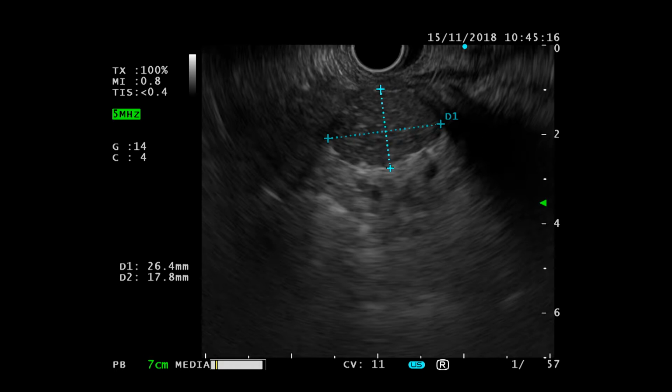I made the point because I'm also concerned about this position, because it's a little bit far down into the duodenum. This may cause some trouble to the advancement of the needle. And the other question to all the experts: this is a very borderline situation where we need good information from the pathology. Is this a unique situation where ROSE may be helpful?